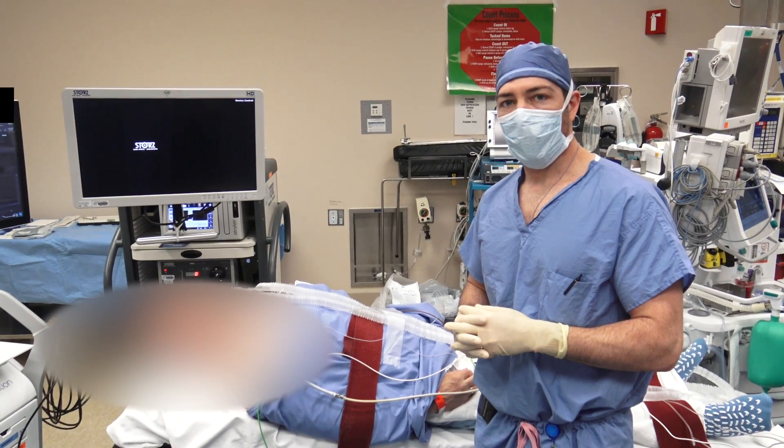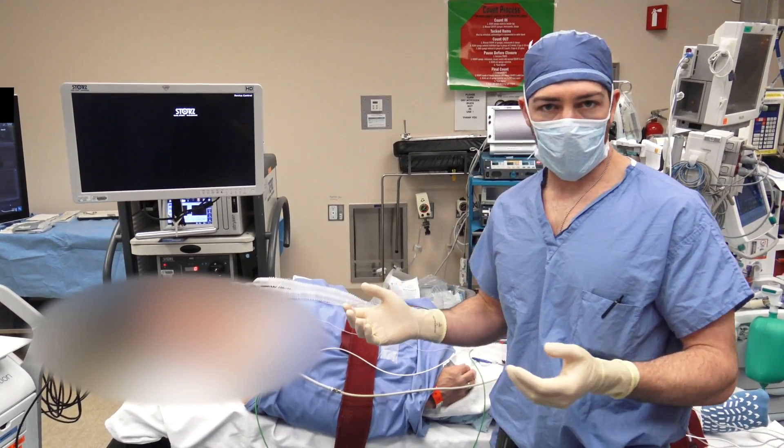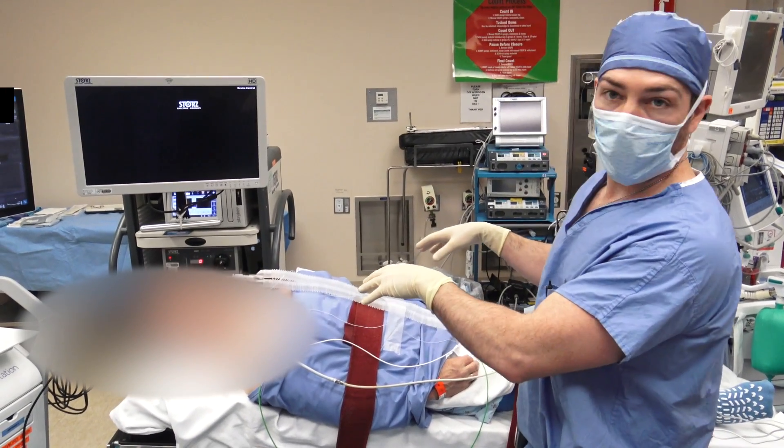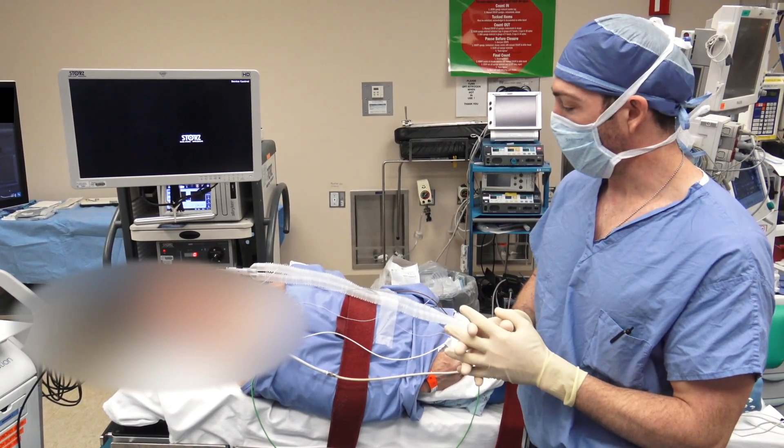We're going to go through a bit about patient positioning for sinus surgery. As you can see, in this room, the patient's already been turned from our anesthesia colleagues. I like to go 180 degrees; 90 degrees in certain rooms is also okay and preferable.